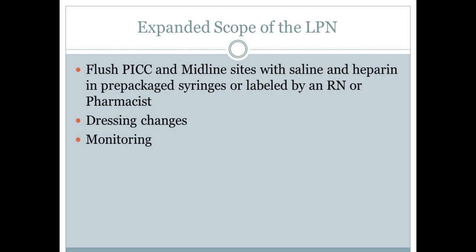You'll also be able to do the dressing changes for the central lines, the PICC lines, and midlines specifically. And the dressing changes for both of those are going to be the same. And again, we'll discuss it and go through it on your skills checklist in another lecture.